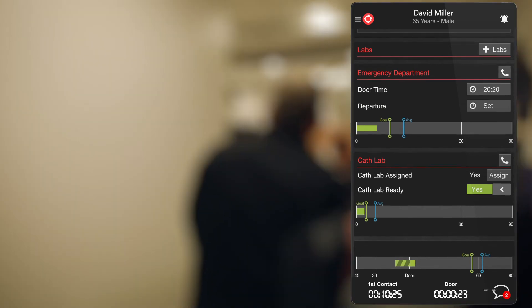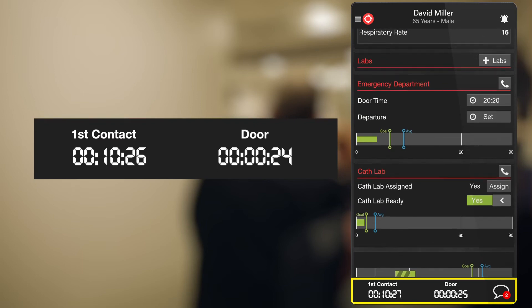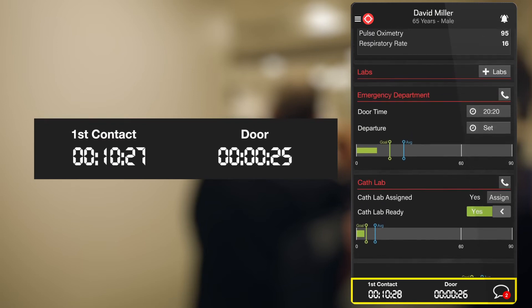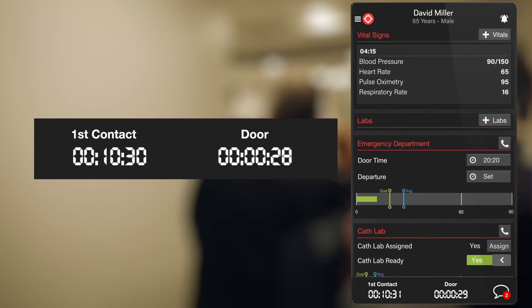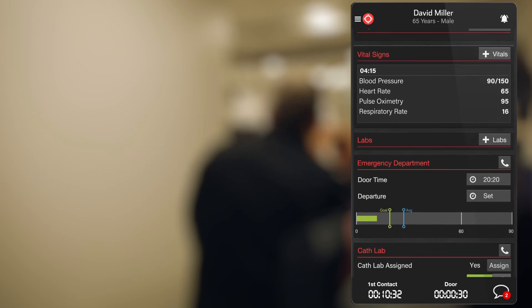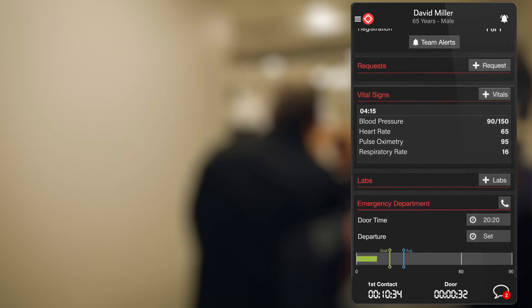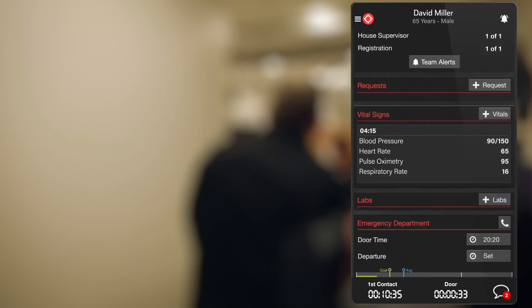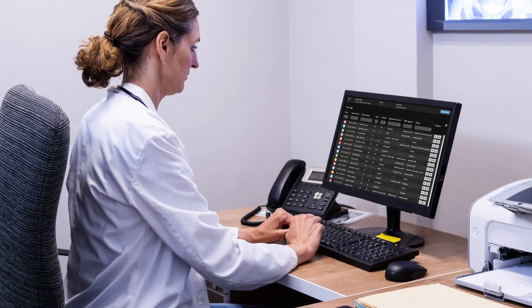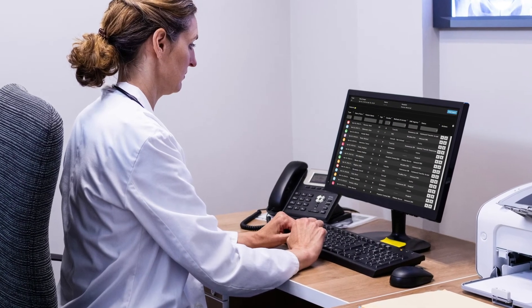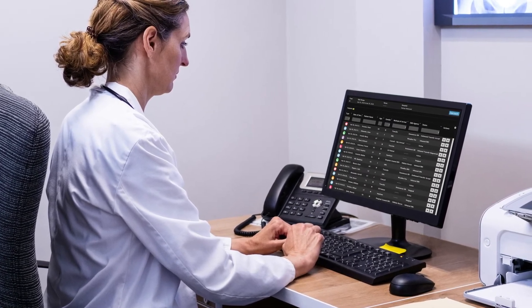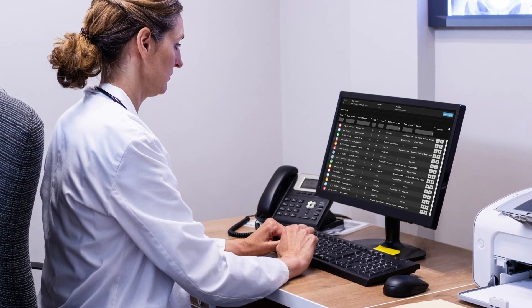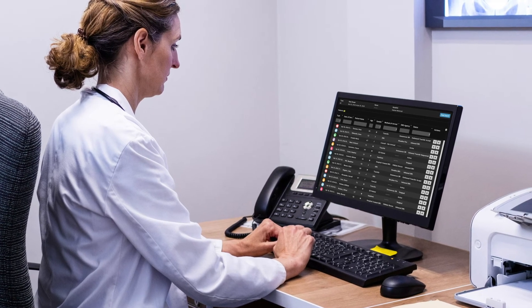Notice how our universal clock helps keep everyone in sync throughout the duration of the case, and timestamps captured along the entire patient journey simplify reporting requirements. In fact, hospitals and EMS agencies can even sync this report with their EHR or ePCR to add the Pulsara data to the patient's record.